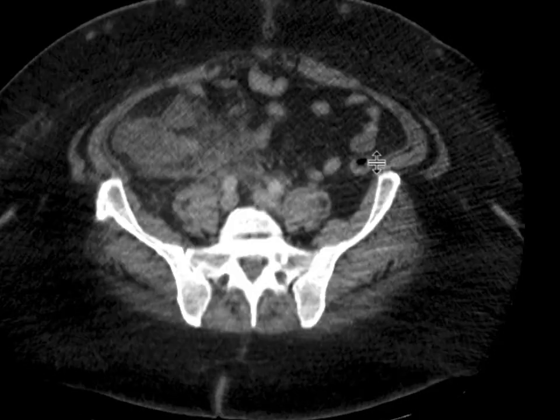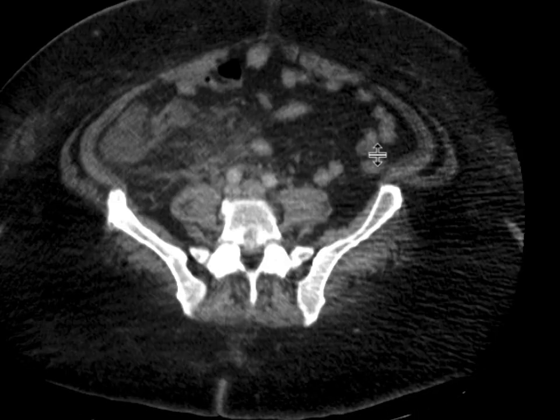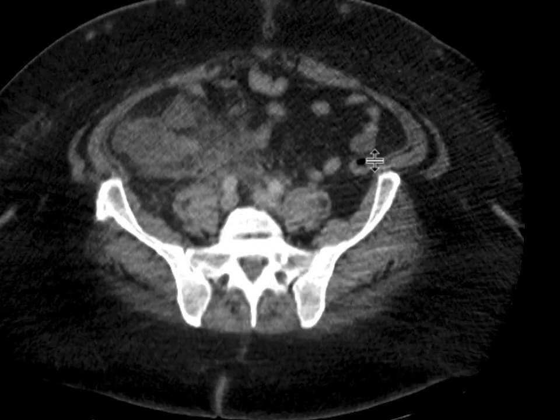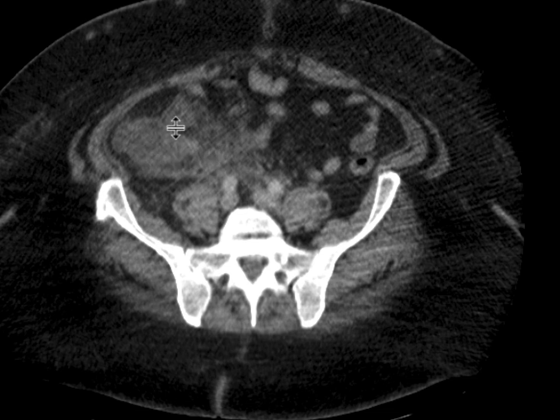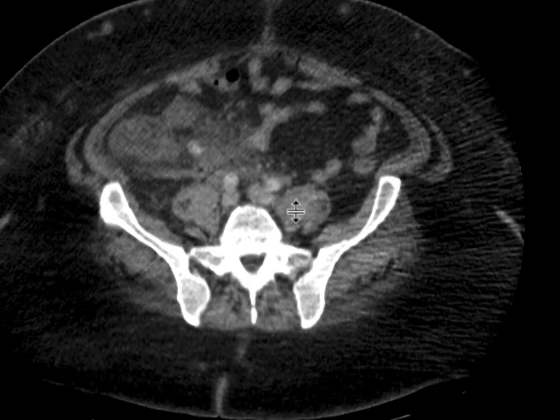Looking in more detail, we can see that this is the cecum over here. This is the terminal ileum joining it. Really coming from the cecum is this structure, and it contains a high-density focus.